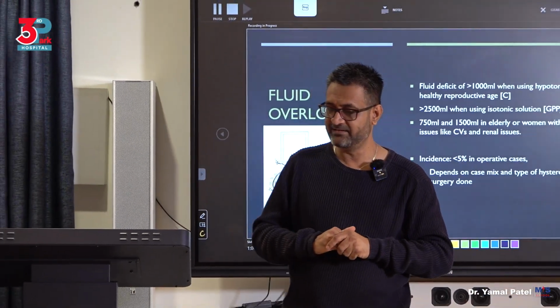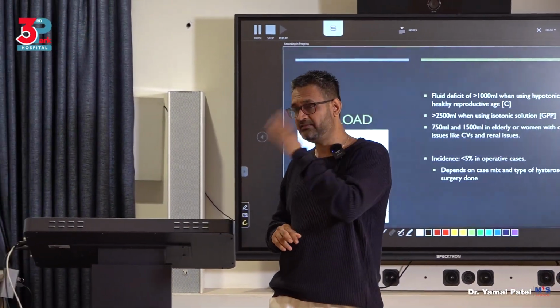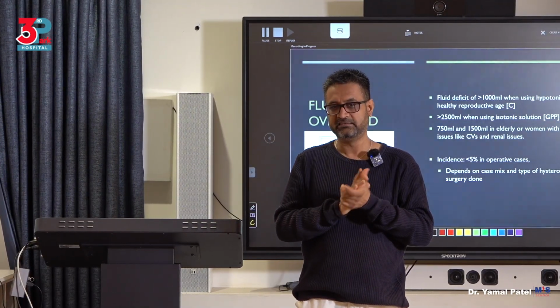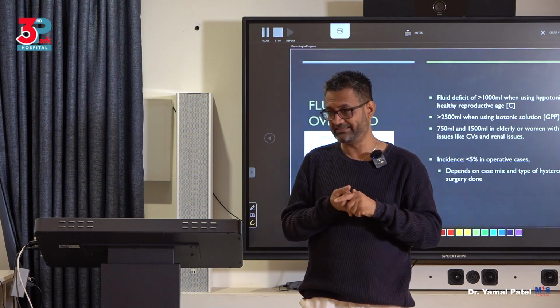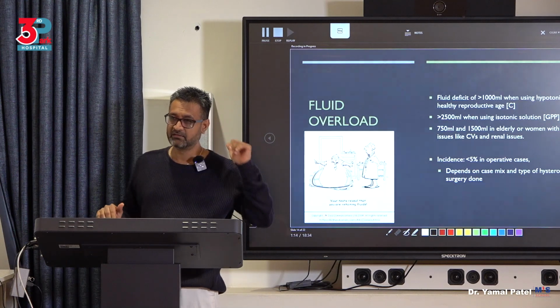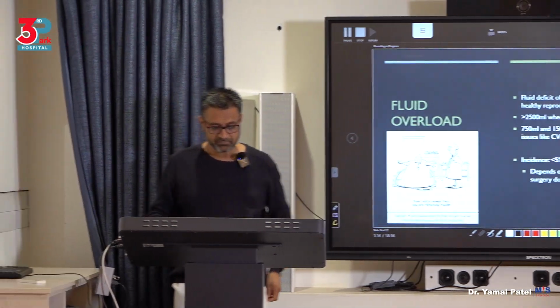Okay? And then reverse the patient, let her recover, talk to her later, tell her we will do a second procedure, second sitting. It's allowed. But you're safer that way than to deal with the overload issues.